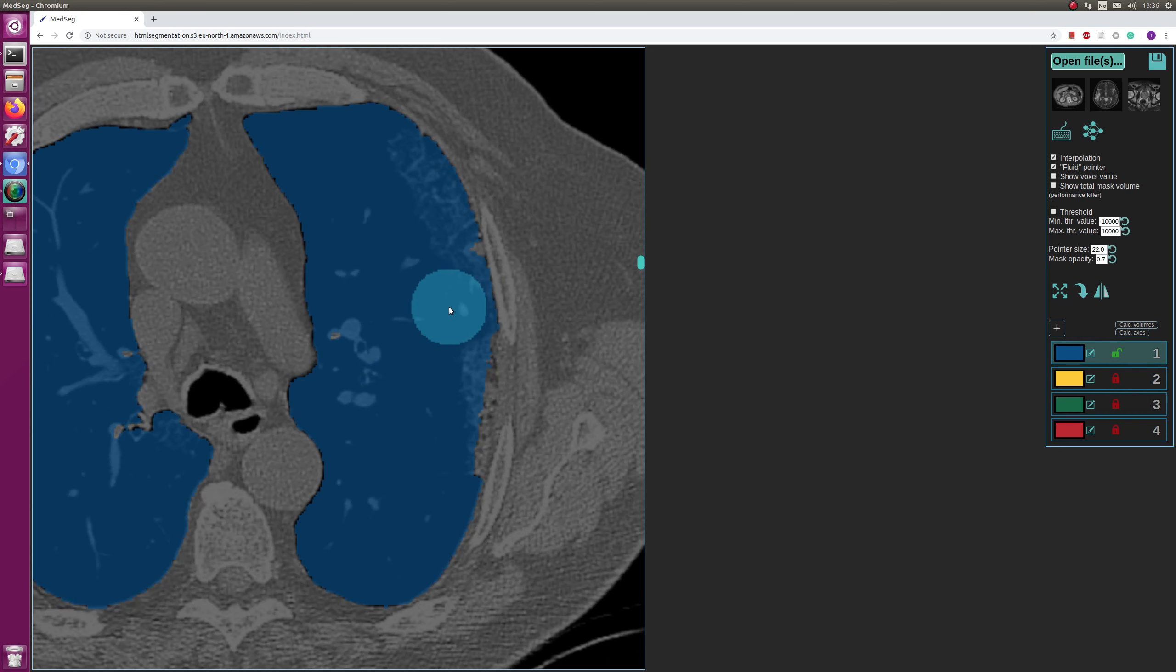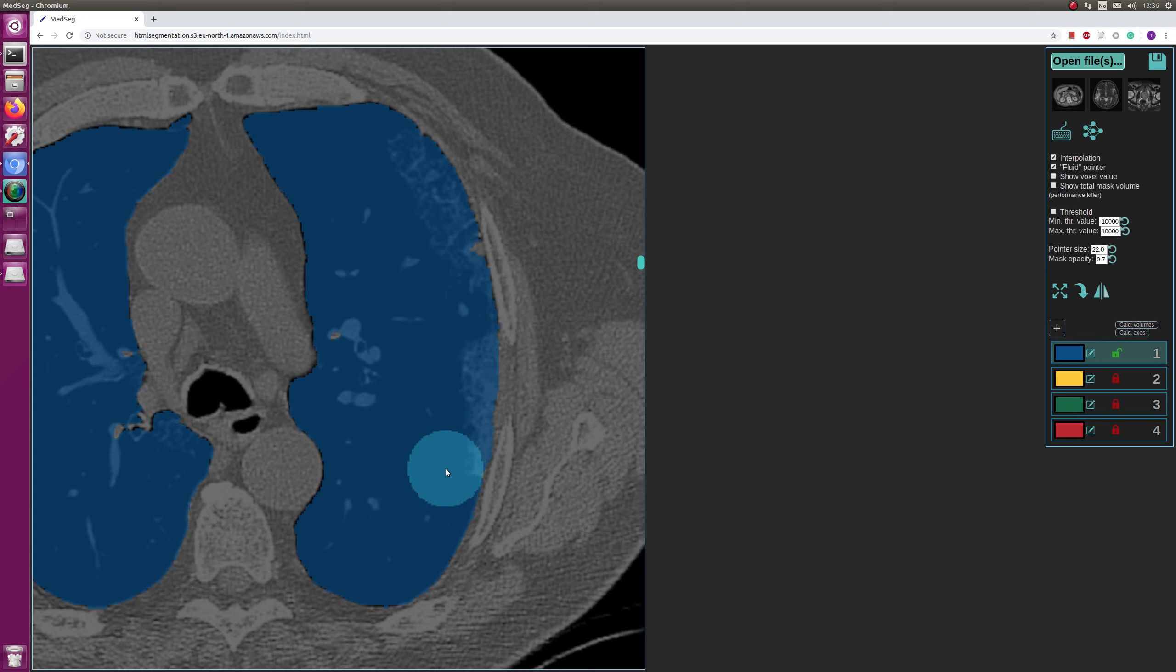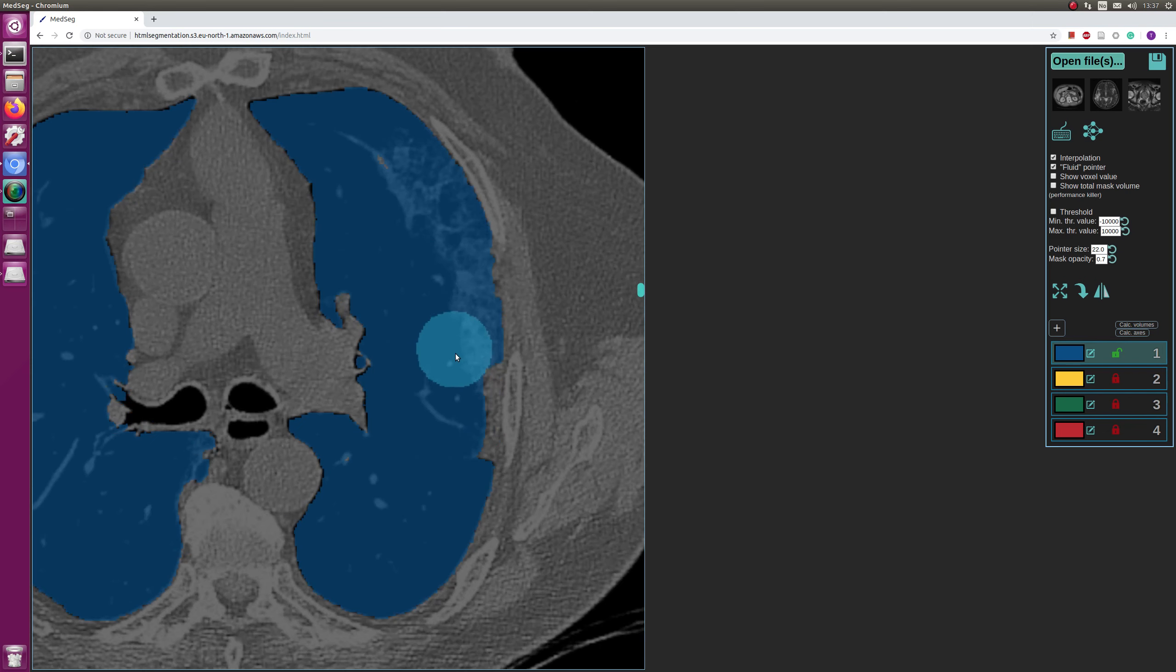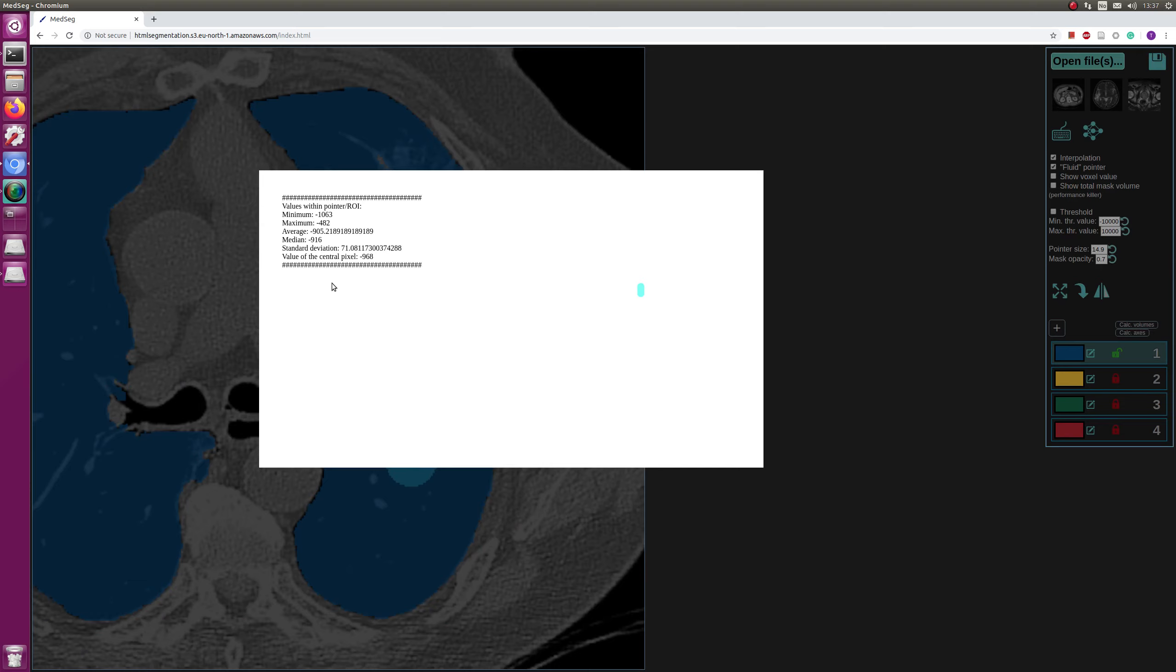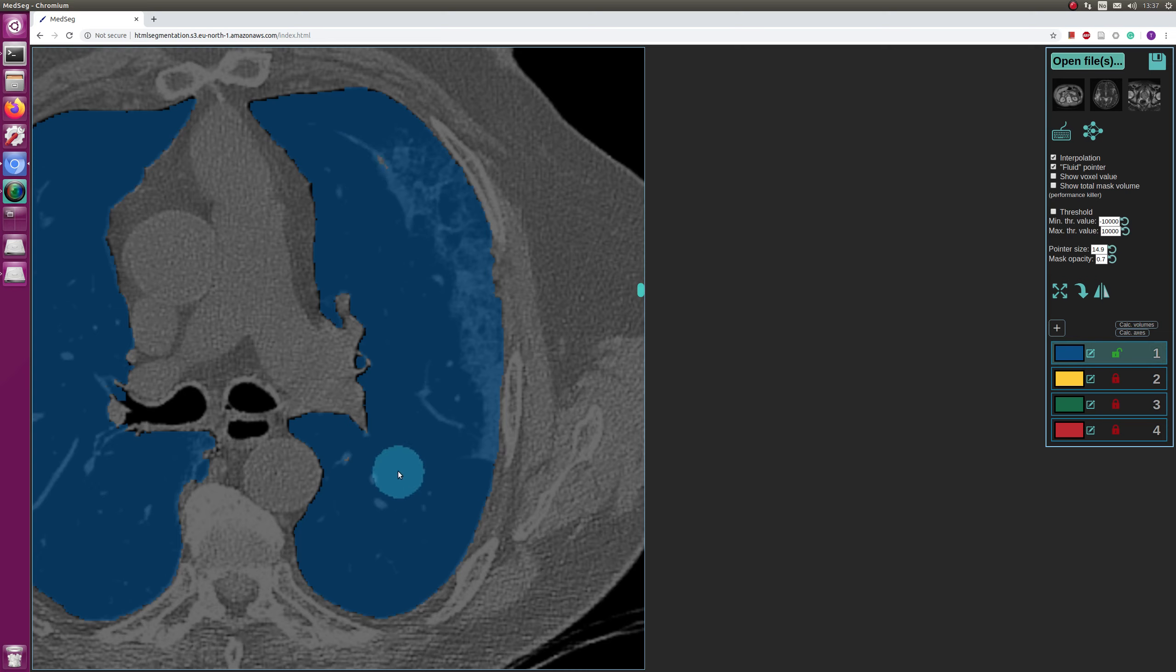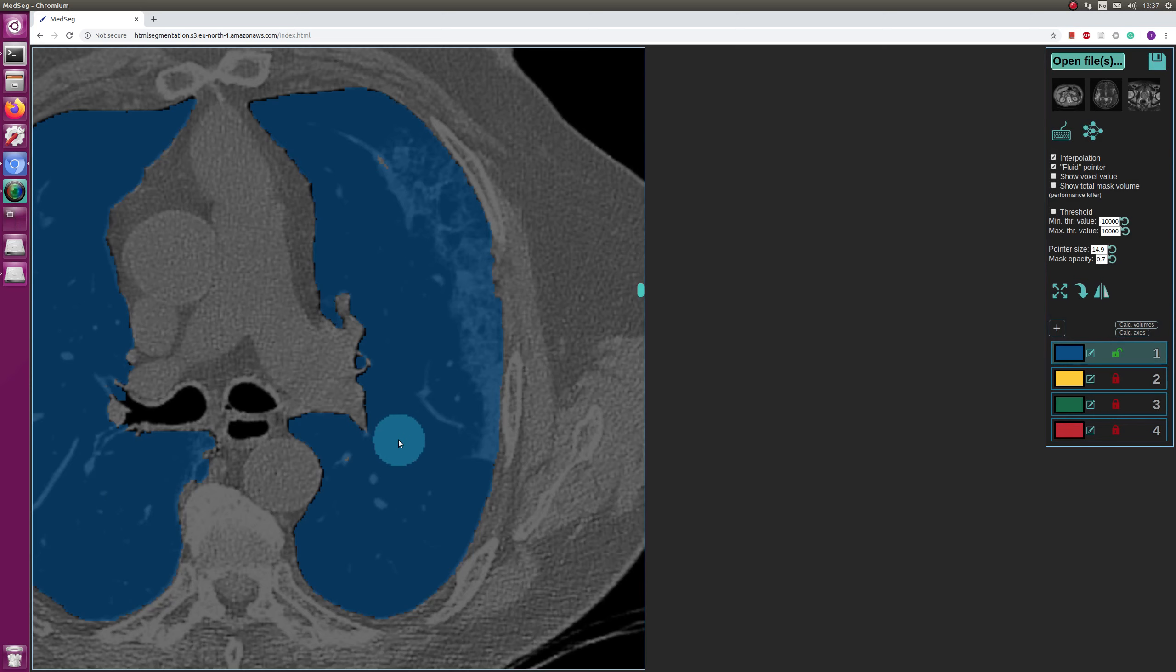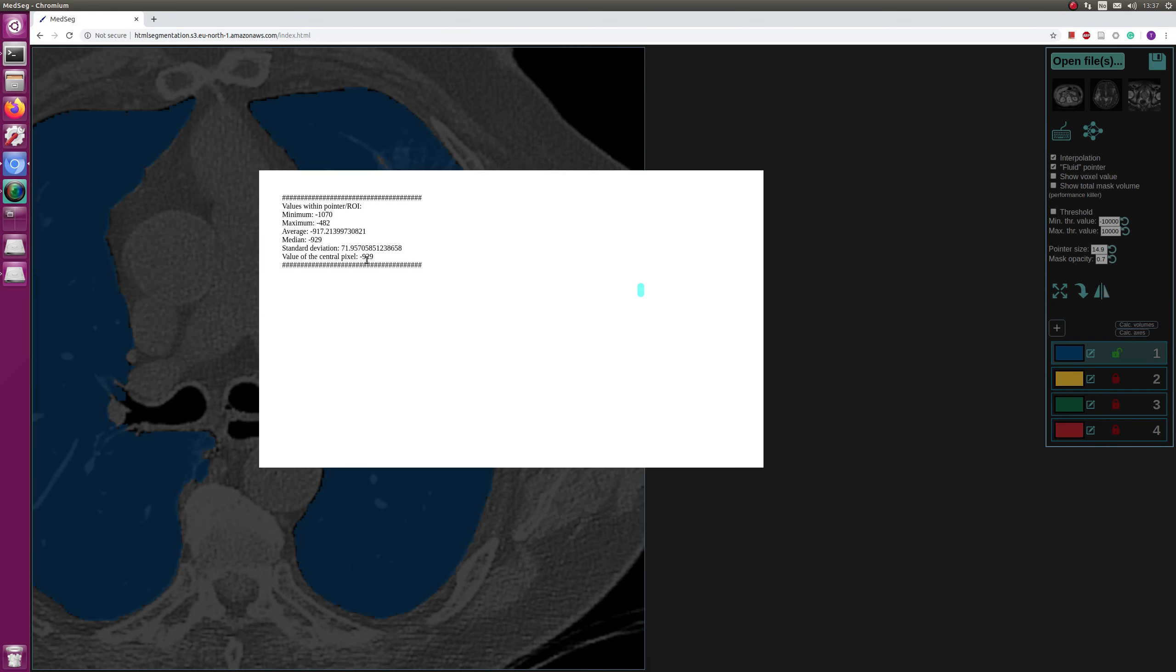And then I will show you how to correct all these. You see there's quite a lot of black around, and for that we will use thresholding. So either you can manually set the thresholding and write it here, or I will show you a function that we have that makes it a bit faster. So if you would press the letter I here, then it will show the values within the pointer. And the pointer is this bright blue circle.